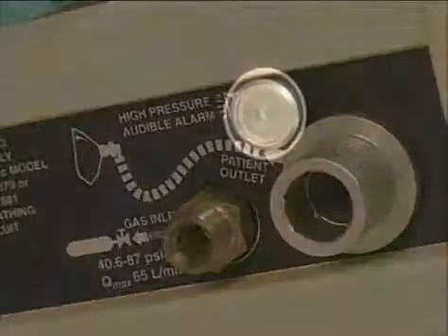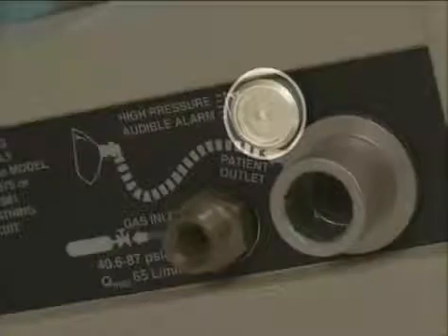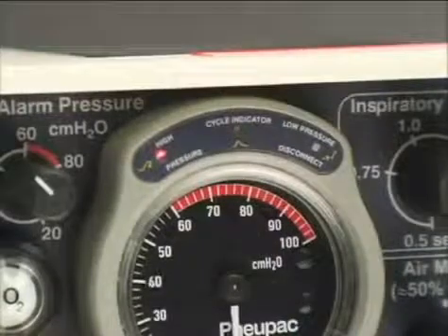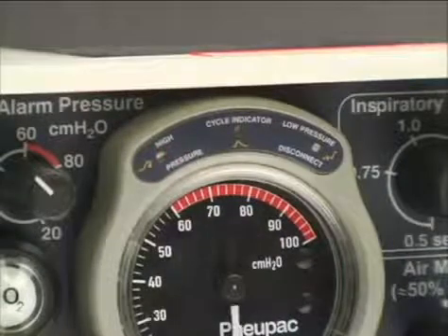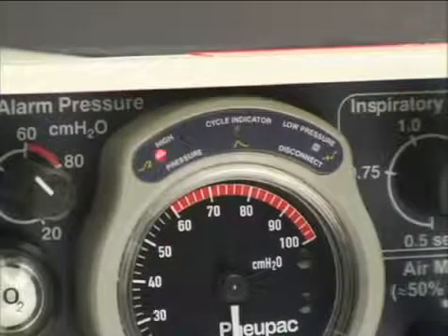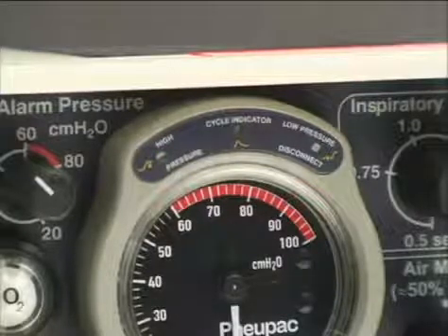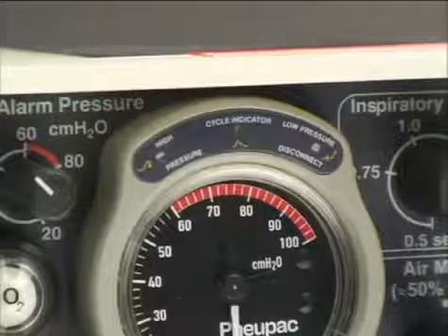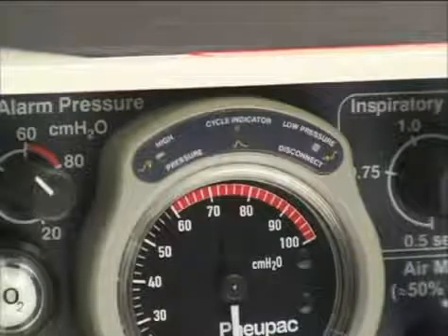This pneumatic audible alarm signals attainment of relief pressure and gas loss through the relief valve. Backing up this pneumatically operated alarm is an electronically generated audible and visual alarm that flashes red and continues 10 seconds after the warning circumstance ends. The cycle indicator is used for continuous monitoring of inflation pressure during patient ventilation. Each time pressure rises through this set pressure level, you'll see the green cycle indicator flash.